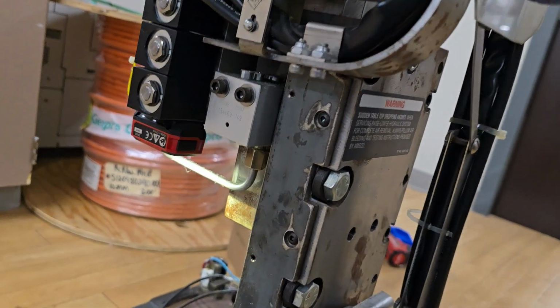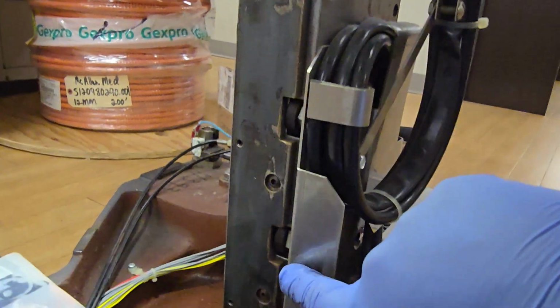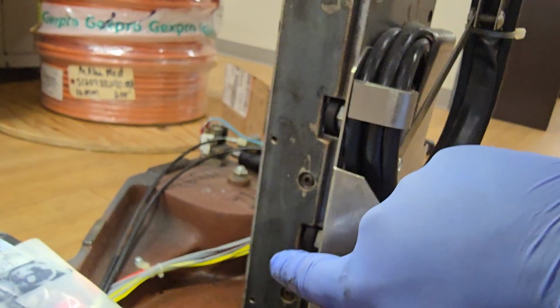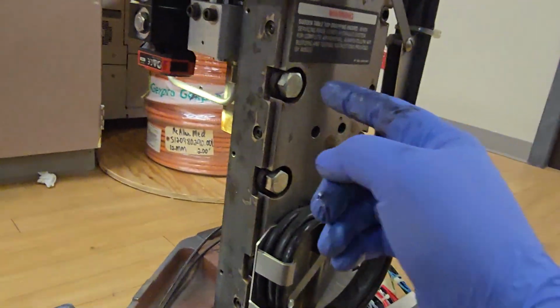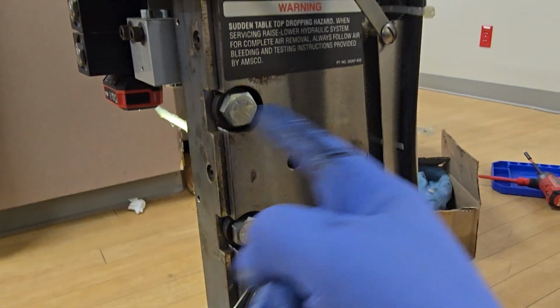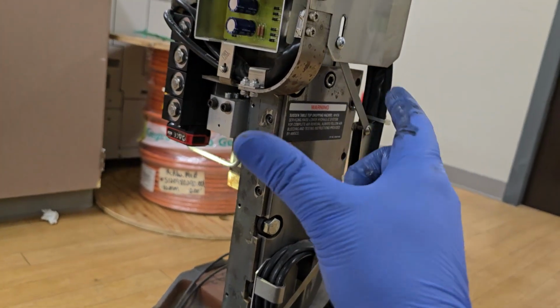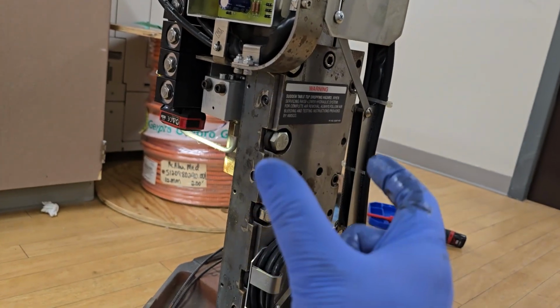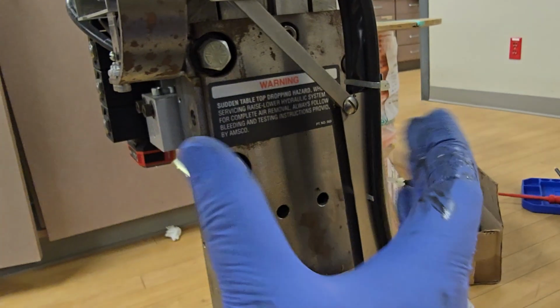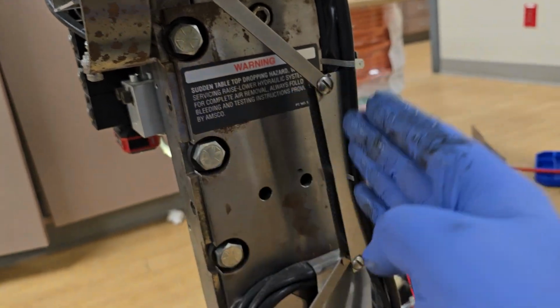Has to be done. And then notice we have these fasteners. This is your lash plate. So on your lash plate, you have these set screws, which actually push in on the rail. So that's one of the reasons why these are floaters, is because we're adjusting horizontally. There's two adjustments that you have to make sure that you do on these guys. One of them is your parallel. So you got to make sure that they're parallel all the way down. The other one is to make sure that they are tight.